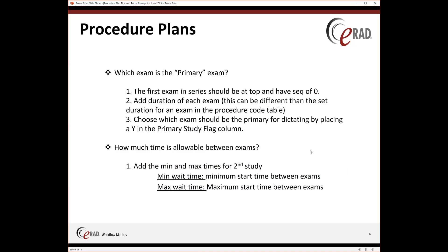How much time is allowable between exams? You're going to want to add the minimum and maximum times for the second study. The minimum time typically is going to be zero because you've already given your first exam its duration. The maximum time is whatever you think is appropriate — for example, if a mammogram is set for 8 o'clock with a half-hour time span, but you can go all the way to 9 o'clock for the ultrasound to have more time slots available, you can make your maximum start time 30 minutes.